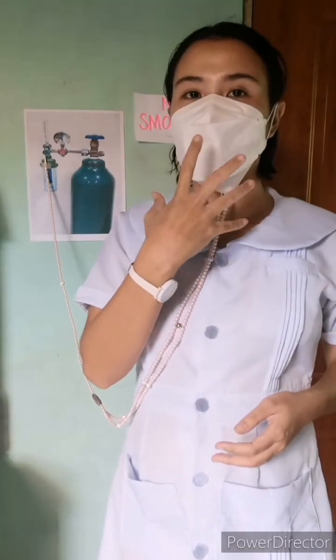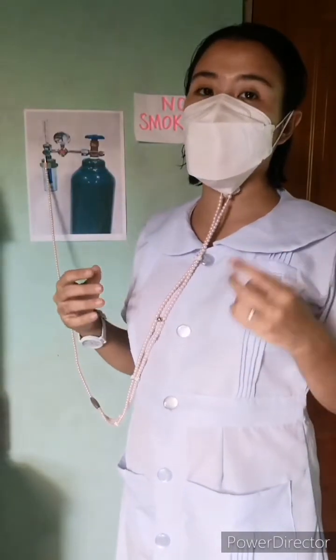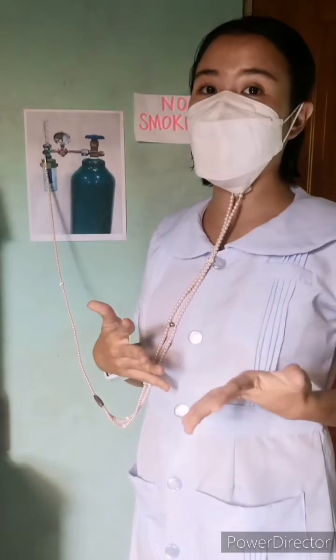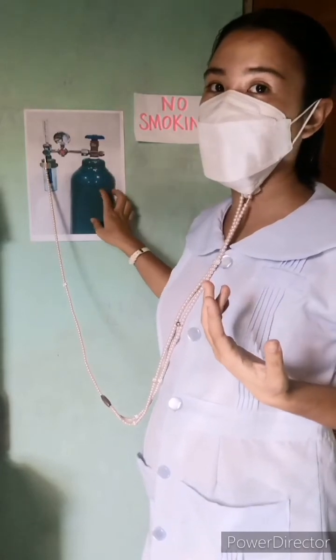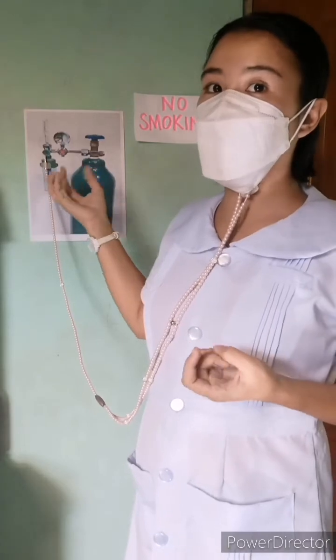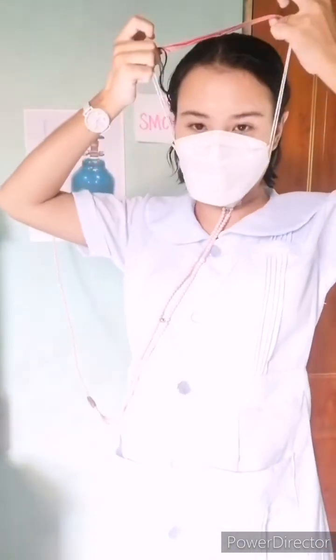Then assess the client regularly to make sure that the device is in the proper position and the patient is getting the oxygen that he needs. Then inspect the equipment regularly to make sure that the patient gets enough oxygen. Especially, always check the tank if it has oxygen and also the humidifier if there is still water. Now I'm going to take it off.